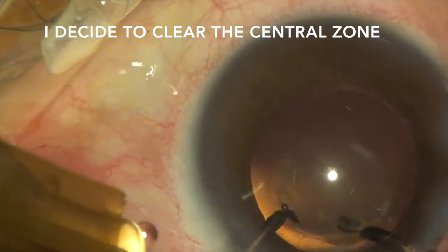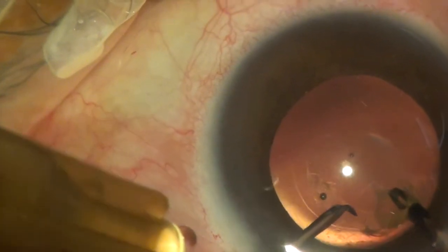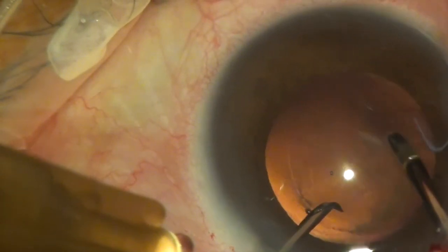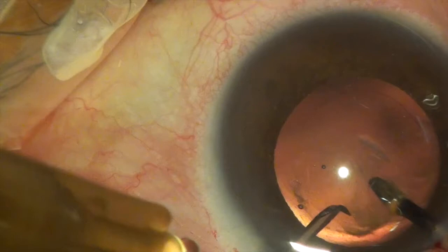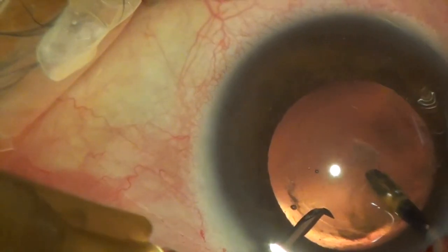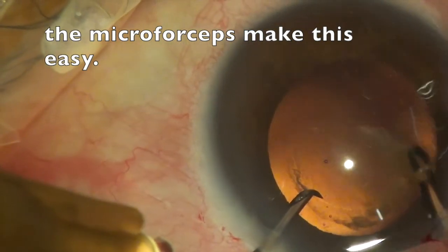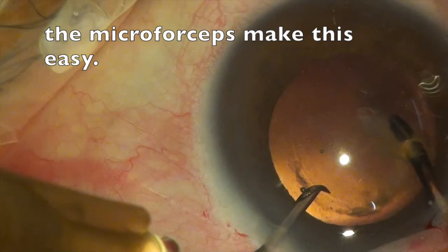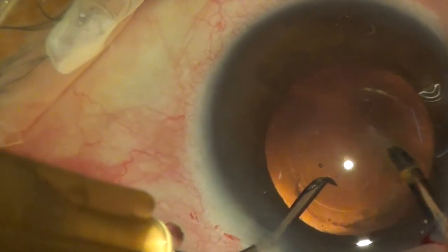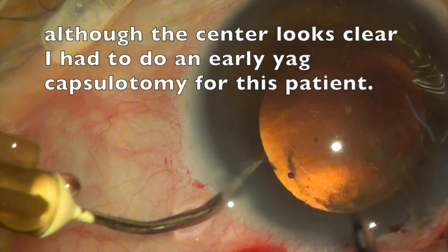I always try to tailor the size of the PCC to the size of the undilated pupil of the patient, so very large PCCs are rarely necessary. They can usually be between 3 and 4mm in size. Since most of the plaque came off, I didn't feel like opening up the posterior capsule. Although the center looked clear, I had to do an early YAG posterior capsulotomy in this patient.